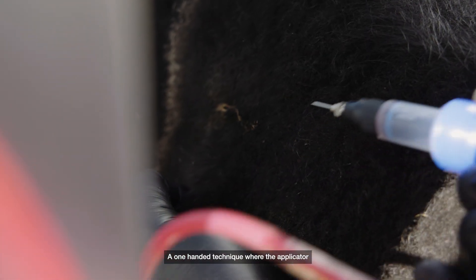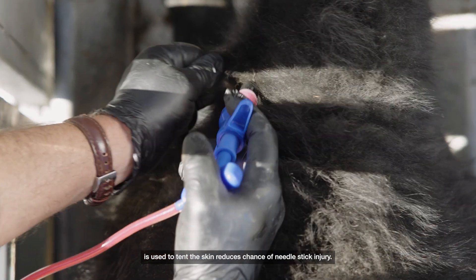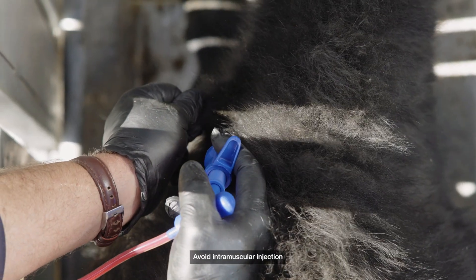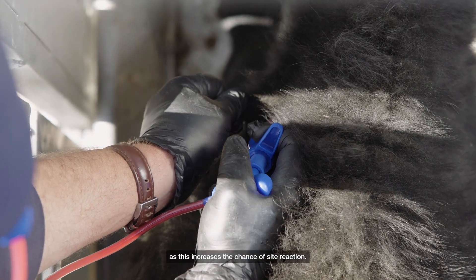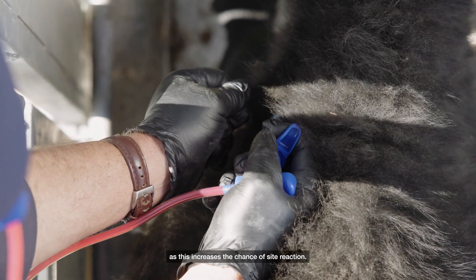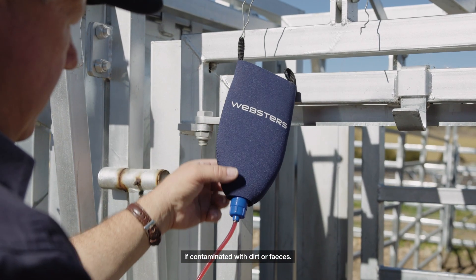A one-handed technique, where the applicator is used to tent the skin, reduces the chance of needle stick injury. Avoid intramuscular injection or injection through wet or dusty skin as this increases the chance of site reaction. A cloth can be used to clean the area if contaminated with dirt or faeces.